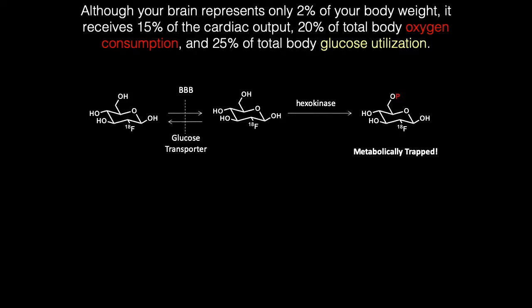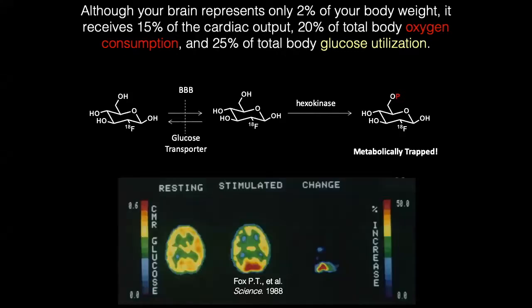And so when you are talking about brain mapping, which some of you might be doing, one of the very first brain mapping studies was actually done with FDG PET, not with fMRI. Here you can see an example from back in the 80s where a visual stimulus showed an increase using FDG PET in the occipital cortex. So FDG has many different uses, depending on the kind of question you're asking.